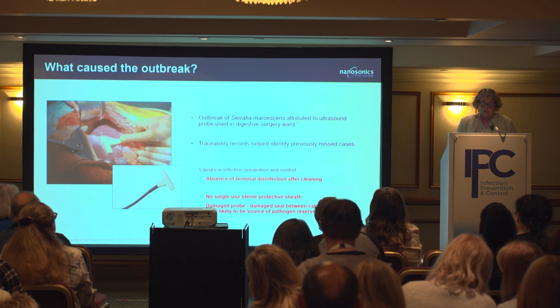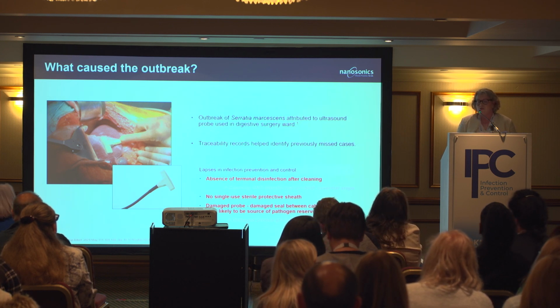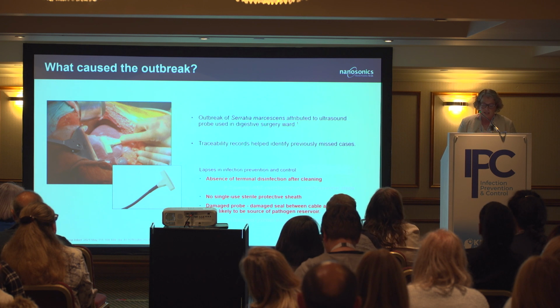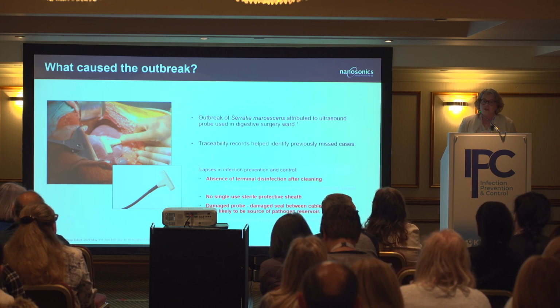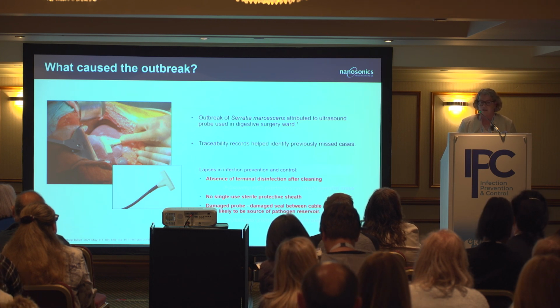The protective cover they were using, they removed it because they wanted to get a better image quality. So this is where, again, a gap of understanding that if you're removing that layer of protection, you're actually putting your patient at risk. And so they also recognized that they had a damaged probe. So no doubt that damaged probe, where they could see the seal between the cable and the probe body, was their actual source and their reservoir of that pathogen. So they're infecting patients, immunocompromised cancer patients with a multi-drug resistant organism. So the challenge is in trying to treat that patient, and the outcomes of that patient are really, really difficult.